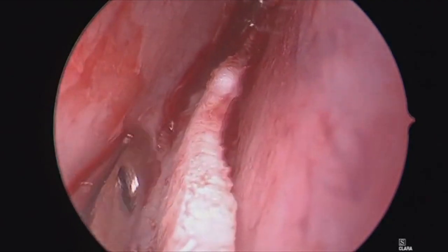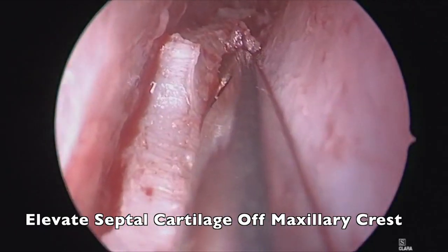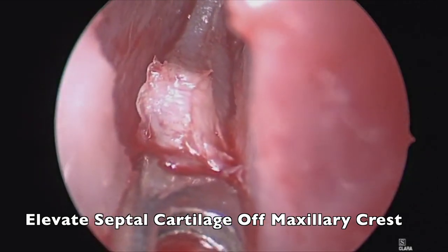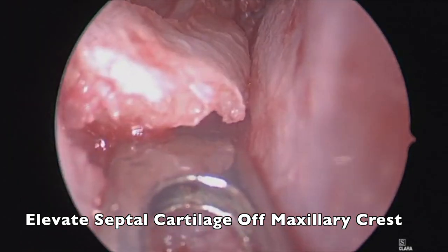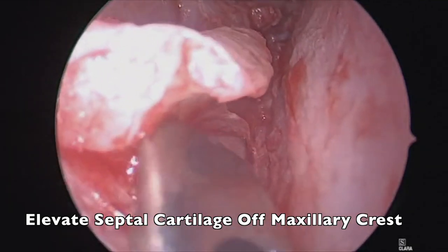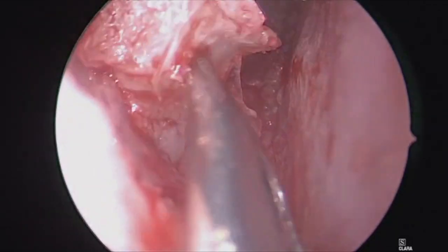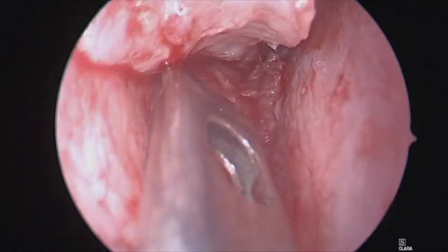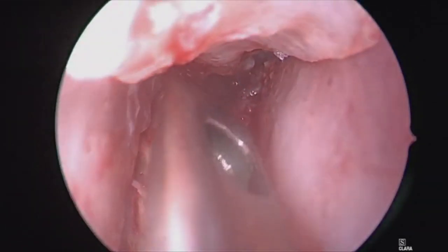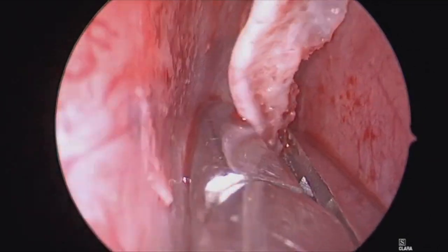The cartilage typically flares a bit inferiorly where it connects to the maxillary crest, as you can see here, really isolating this last bit of cartilage. After the cartilage has been completely isolated on both sides, you can use your suction elevator almost like a spade shovel to dig the last piece of cartilage off of the maxillary crest. That allows you to lift this away from the maxillary crest bone in an atraumatic way. This is frequently a challenging area due to that tough transition of the mucoperichondrium to the mucoperiosteum, but if you isolate it on both sides completely, you have relatively little chance of tearing your flaps and can lift that whole piece of cartilage out directly off the maxillary crest.